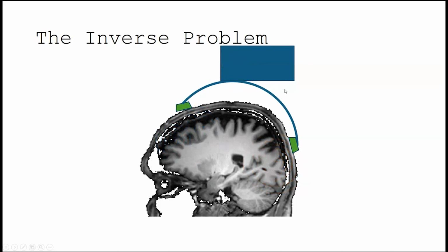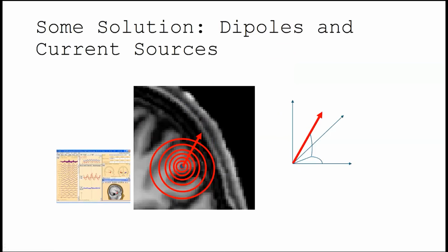Now compare the two: different sources, one source here, one source here, same signal as when we record two small sources and one large source here. We get the same signal. And again, we can play around and even displace the sources slightly in accordance and still get the same signal. So that means on the surface of the head, those signals look the same, and we have to dive into source localization to learn that the sources where the signal comes from are different. And how does this work?